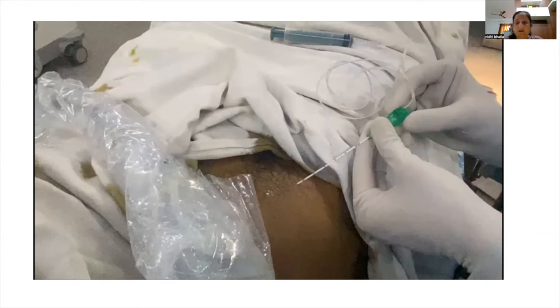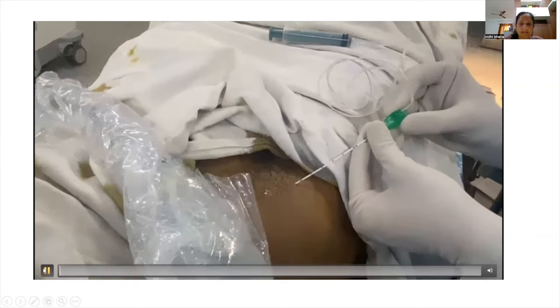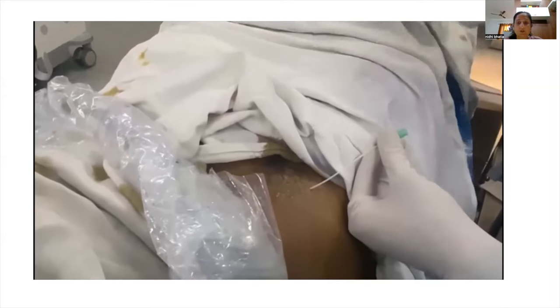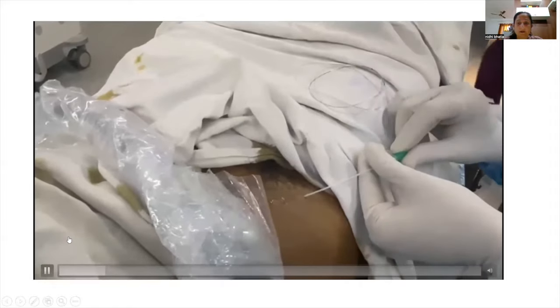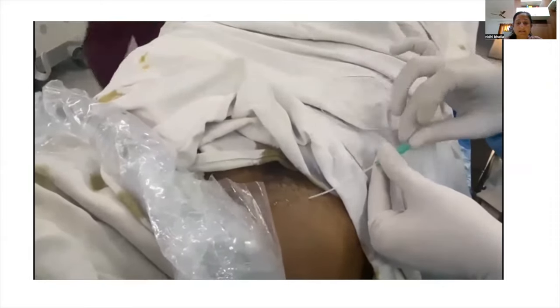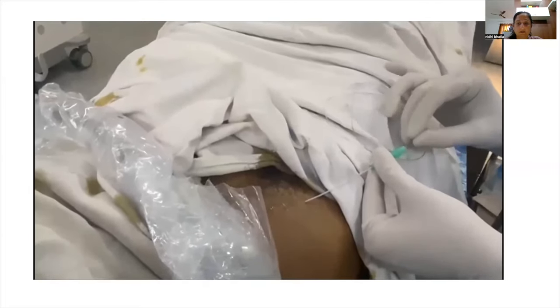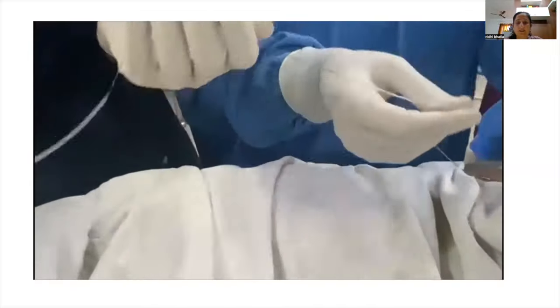At our institute, for patients with fractures, we commonly place catheters in the fascia iliaca compartment. Once the catheter is in place and used postoperatively, it provides very good pain relief for approximately 48 to 72 hours. In this video, after injecting local anesthetic and creating a potential space, the needle is withdrawn and the catheter is inserted into the fascia iliaca compartment.